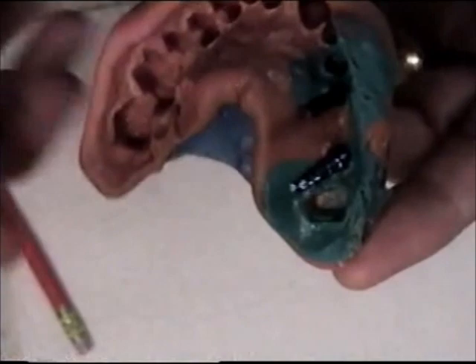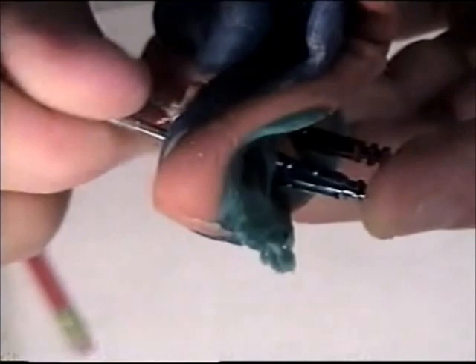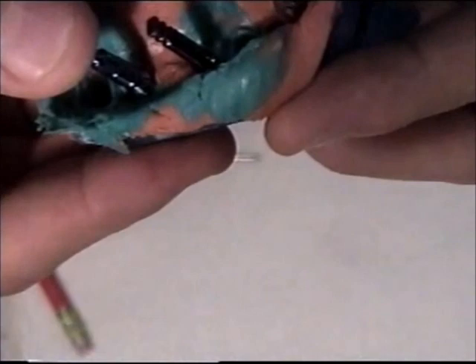Snap it. You can see it wiggles a little bit. So to secure it up, I will go ahead and use my wrench and screw these in place. This will stabilize them even more to make sure that when they were pulled from the mouth, the pickup copings weren't pulled out any. I will push, make sure that they are secure, and they are.